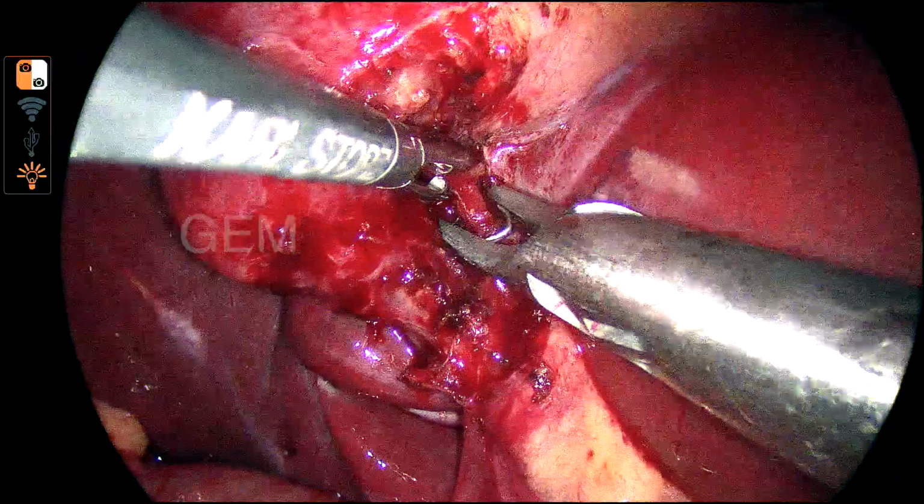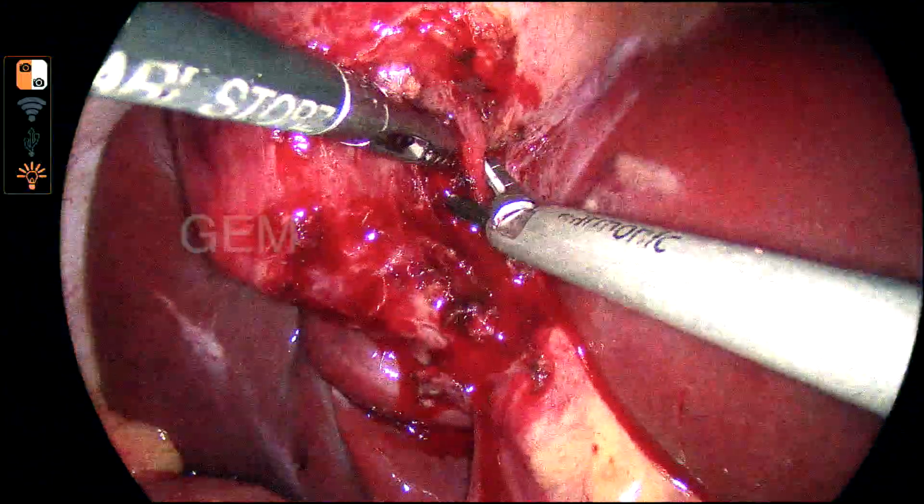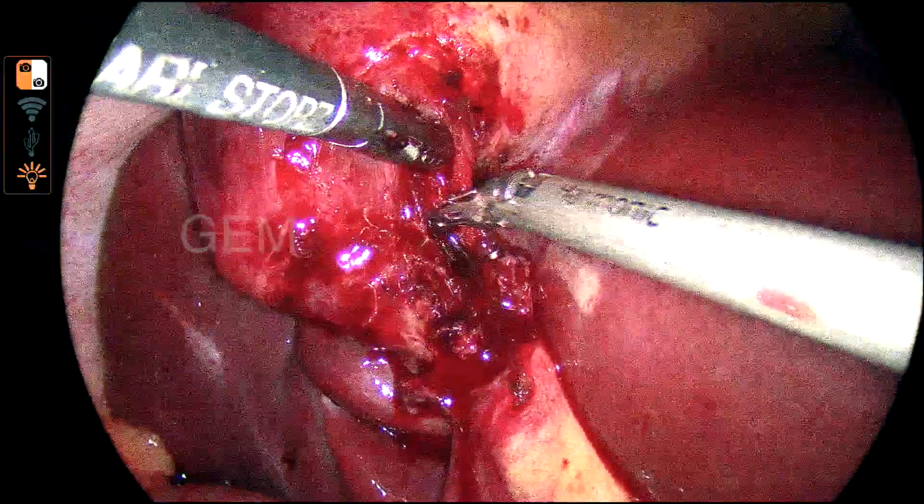So I am applying a clip to the cystic artery. I convert my epigastric port to 10 mm now. I am applying one clip to the cystic artery, and then I am dividing it with the harmonic scalpel.